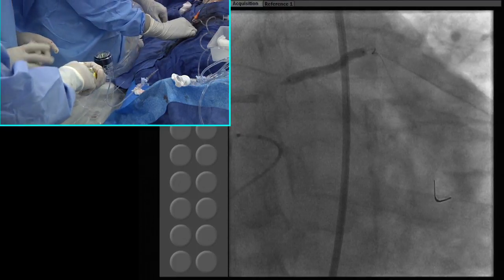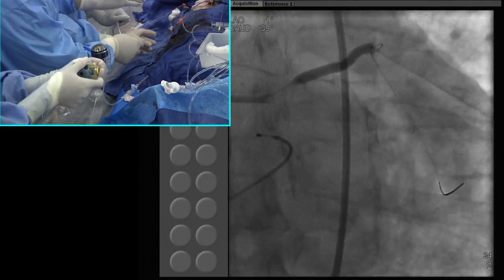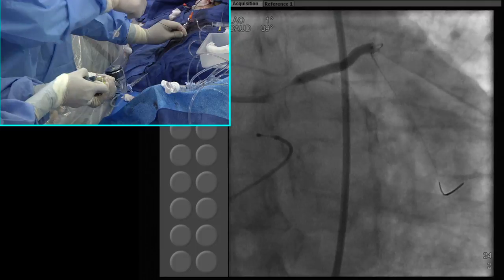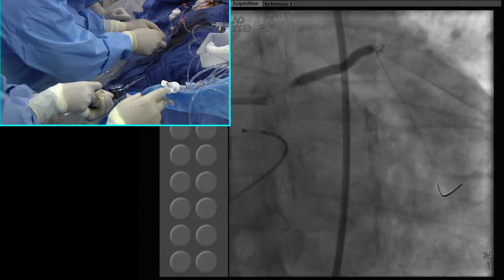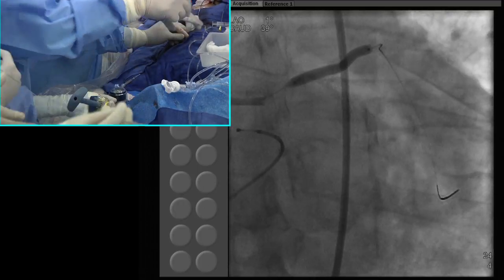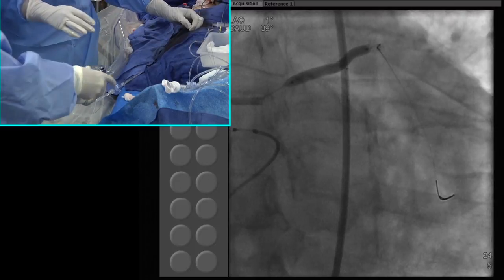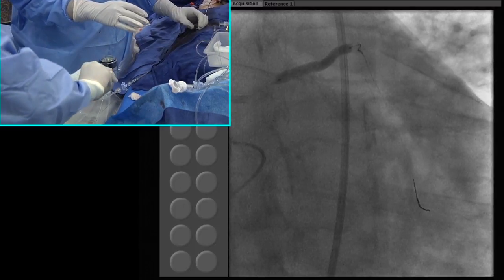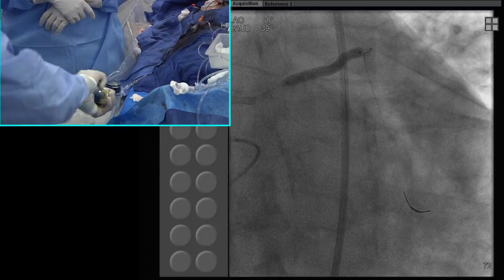He is tolerating very well, and you see my guide is out. Good. Pressure is 120. He's also tolerating well because you have taken some very prudent measures. You just mentioned how you've backed off with the guide there. I think if the guide had been left there, you'd been yelling out for a balloon pump.